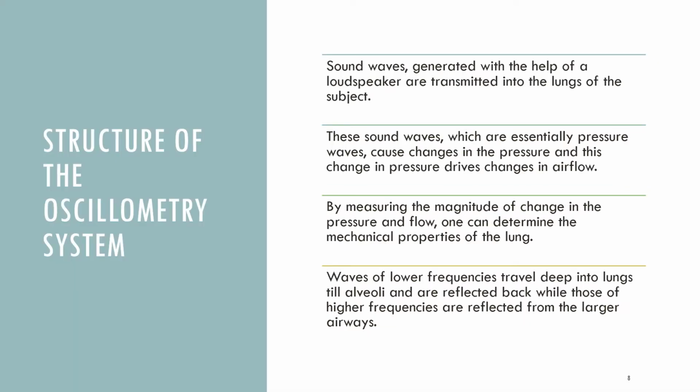So how does this system work? Basically, a patient comes into the pulmonary function lab. They sit down. They put their mouth over a mouthpiece. They have a nose clip. They also hold their cheeks from moving. They keep their cheeks stationary by putting their hands on their cheeks. At this point, they breathe tidal breaths. So they're breathing in, breathing out, breathing in, breathing out.